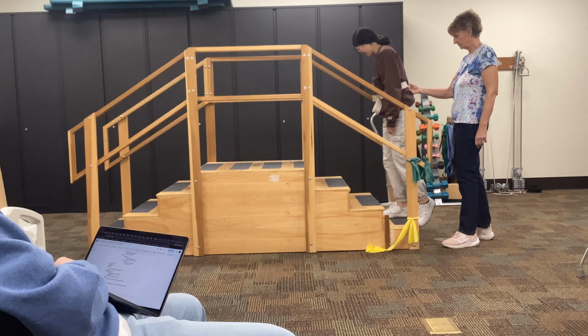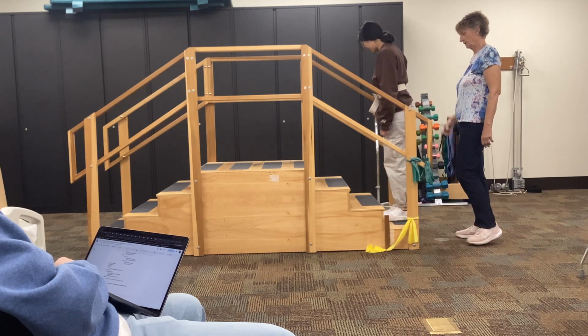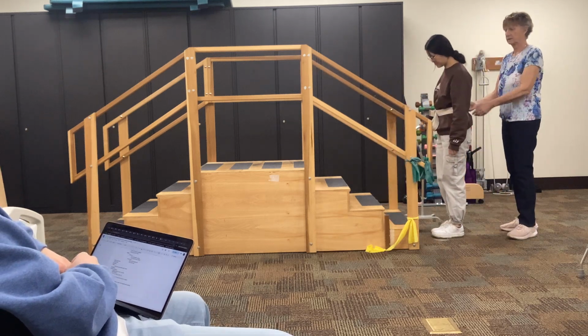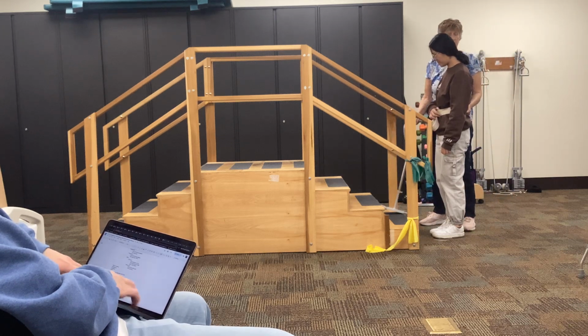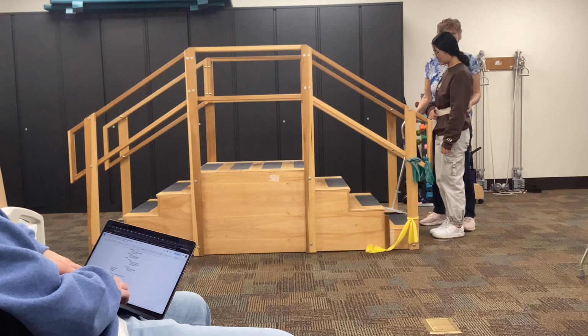It's too big. Okay. Would I go this way? There you go. Okay, come on back down. All right. Oh, yeah, I should get my feet out of the way. Okay, so the large base quad cane, one of the downsides is it doesn't fit correctly or in the same orientation on the stairs.